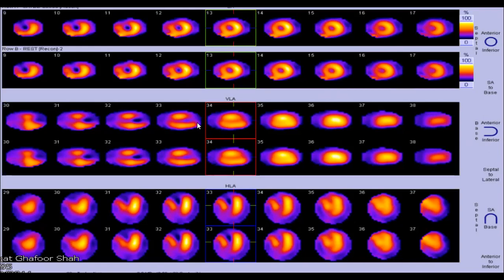segments now. So when it is 5 segments, there is a large size defect. If you compare stress and rest, there is no change. And what is the intensity? It's high severity.